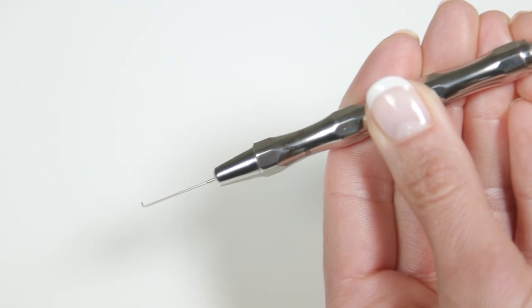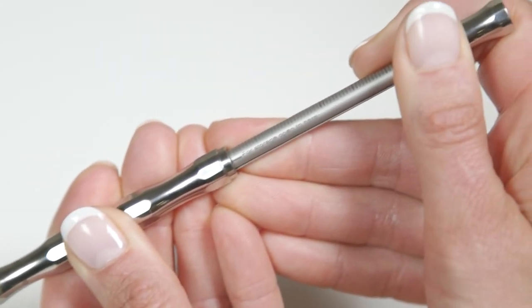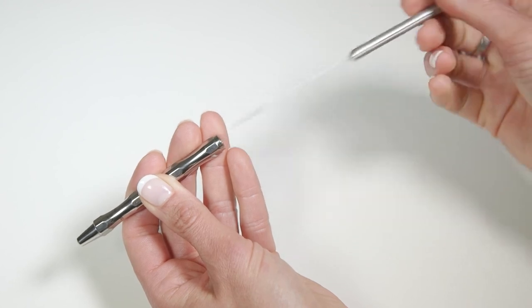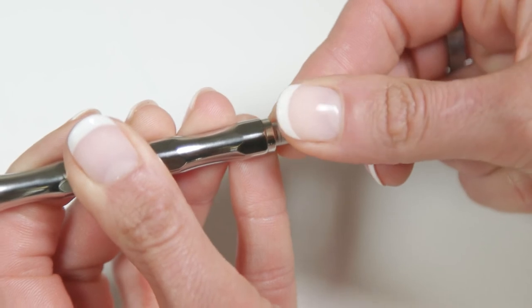The depth gauge is a delicate instrument and should be handled with care. It should always be stored with the probe fully retracted to avoid damage. It should also be taken apart for cleaning after every use and then reassembled prior to storage.